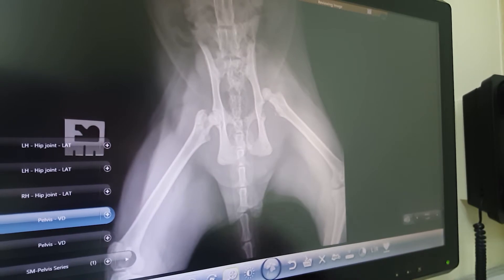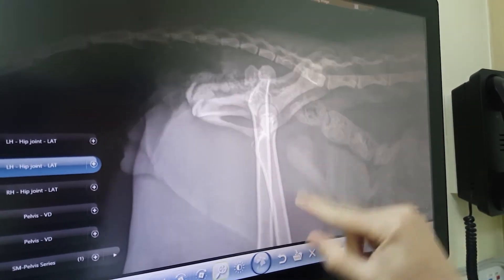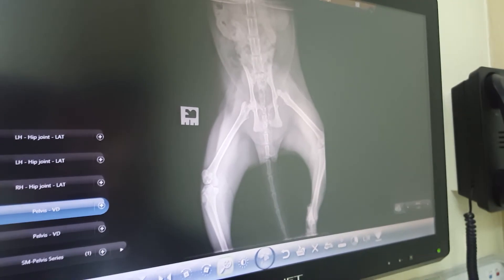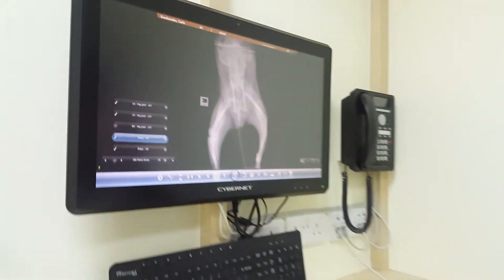Unfortunately in this case, you can see here it's just sitting very high, whereas that one's in. Because he went missing for five days, we don't know when this actually happened. There's a lot of soft tissue swelling, and sometimes we can actually reduce a hip back into place. But in this case, we are not able to because there is a lot of swelling. So we're going to have to decide what we need to do for him, and that will probably be a surgical correction.